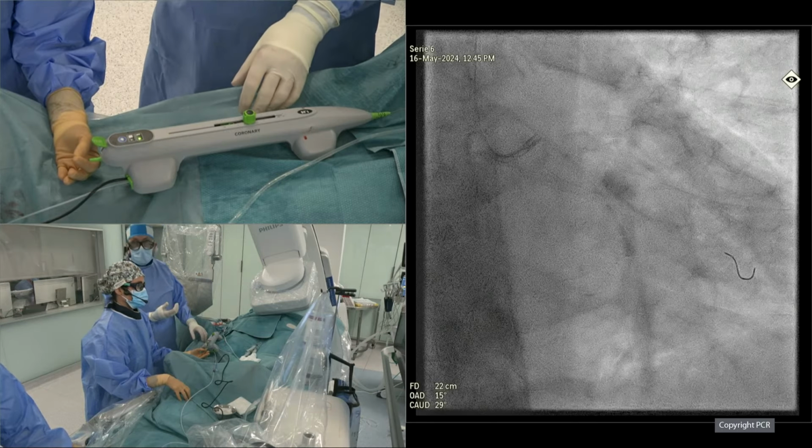From time to time, I release, so I do not have tension. Okay. And I have a signal now that tells me that probably it's a good time to stop. So I have adjusted my ablation to the time needed to reach the left main.